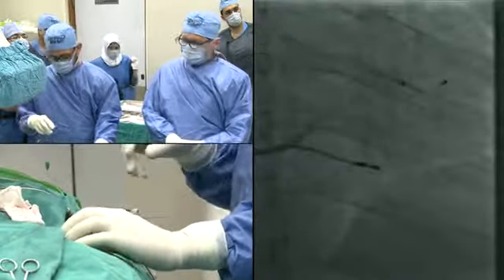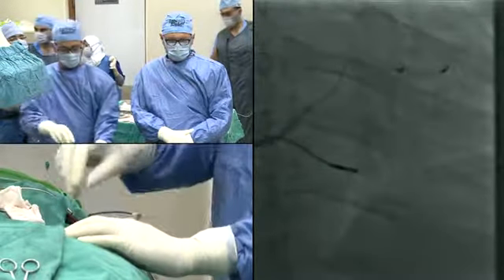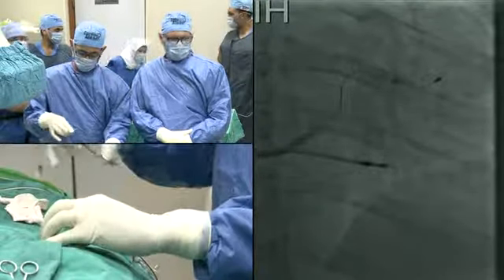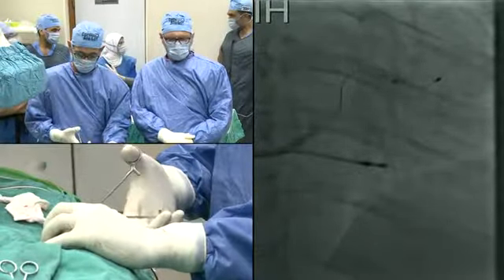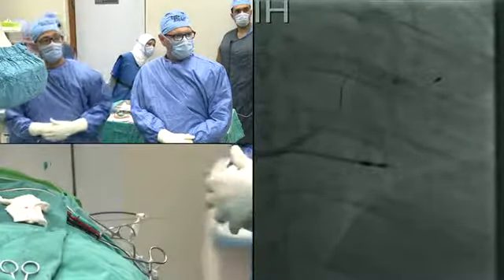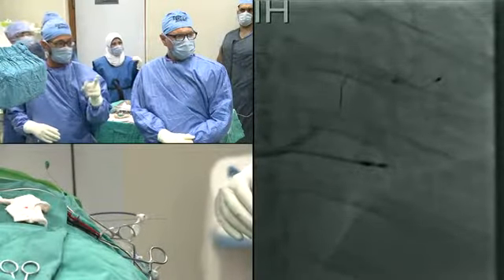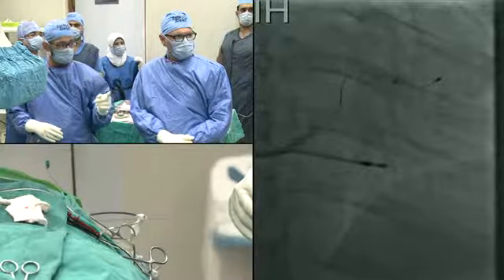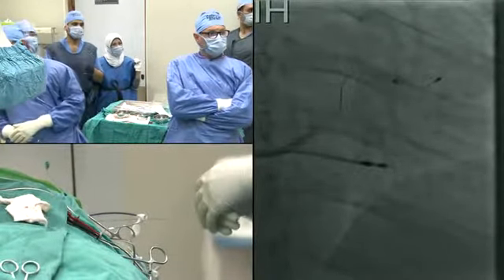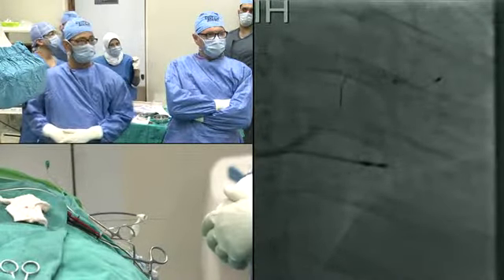Okay. Start measuring. Can we maybe see an LAO position too, just for the audience to see? I'm already scanning while we're checking thresholds. ECG, please. ECG during testing. Can we put the other screen of the ECG on live? Now I'm at 10. At 10, no diaphragmatic pacing. Continue. Okay, 5. Pacing is captured.